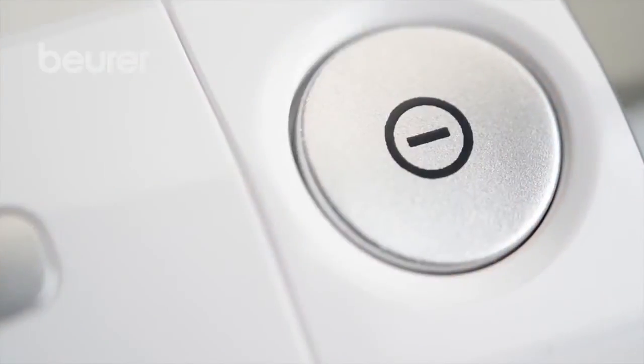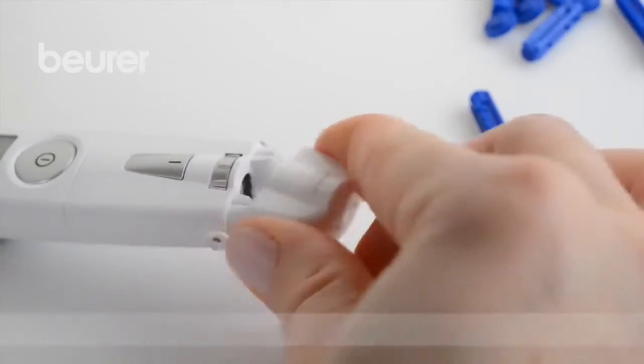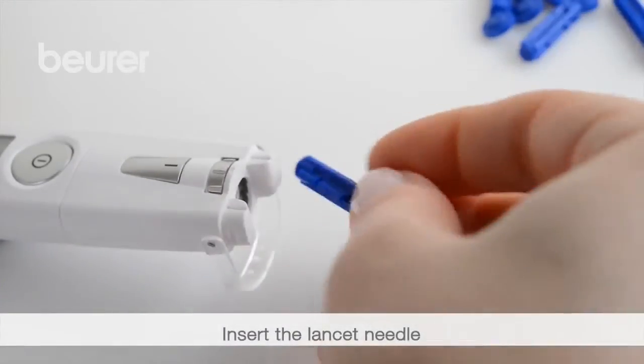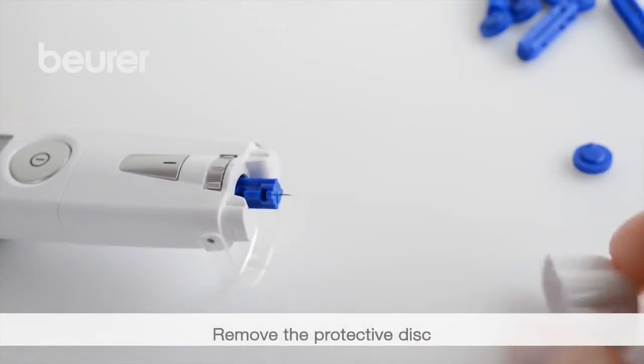The measurement. Remove the cap from the lancing device. Place the lancet needle into the lancing device and secure it. Remove the protective disc from the lancet.